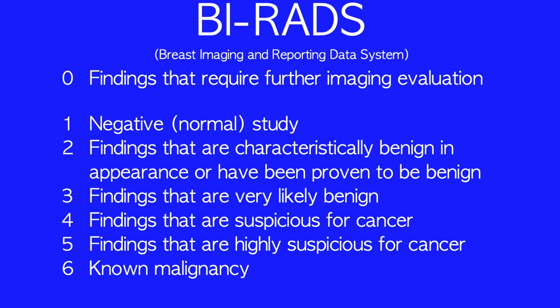Breast imaging facilities will follow patients to the ends of the earth to assure that they get the needed additional imaging. BI-RADS 1 and 2 are assigned when there is no imaging finding suspicious for malignancy. BI-RADS 3 is most commonly used when ultrasonography reveals that a breast mass is probably a benign fibroadenoma, and 6-month follow-up imaging is more appropriate than an immediate biopsy. BI-RADS 4 and 5 require scheduling the patient for image-guided needle biopsy.